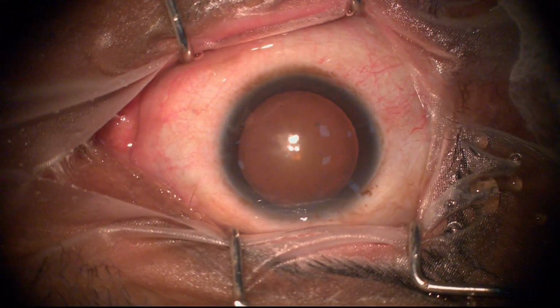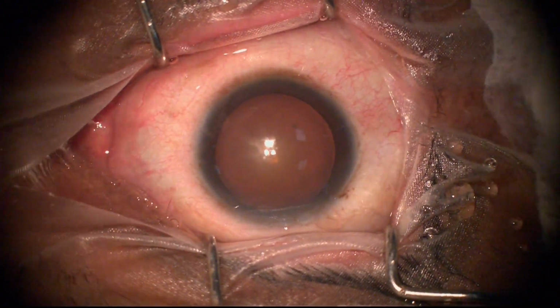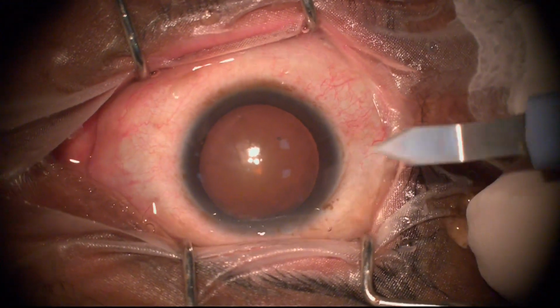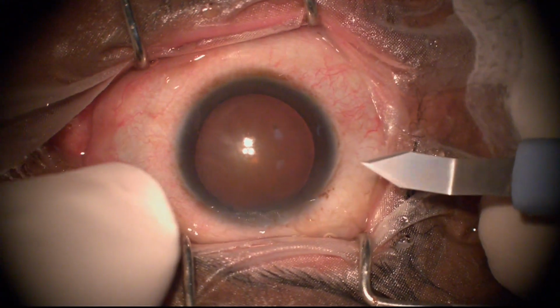Now this doesn't seem like 180. It is not diagonally opposite. See, this scratch is here, and the corresponding scratch should be diagonally opposite. It is not there. So, na, theek hai. That is part of the game.